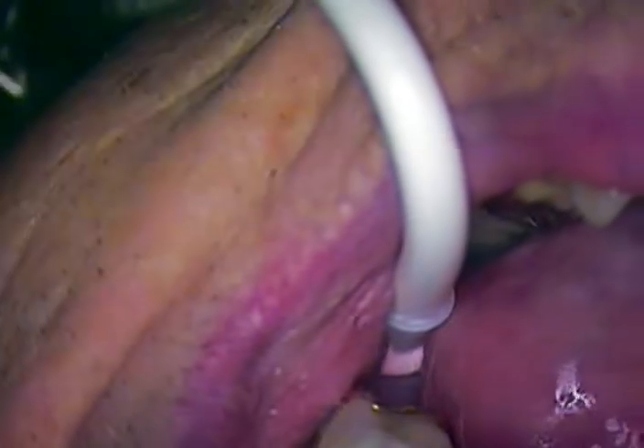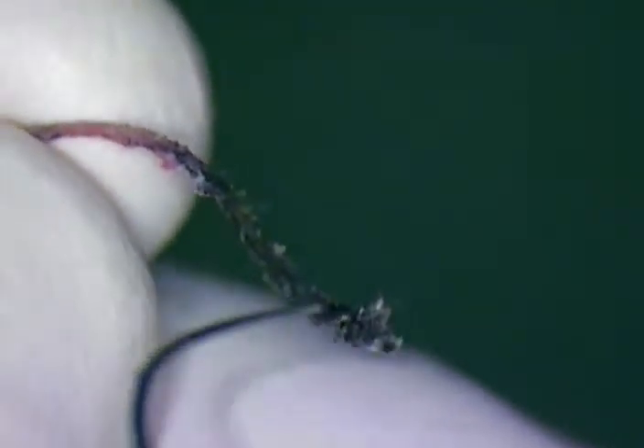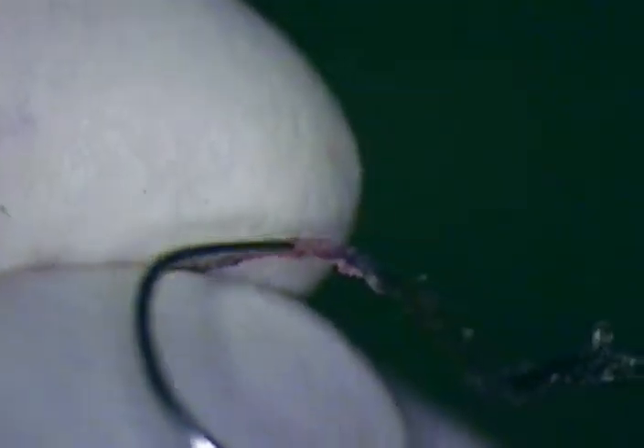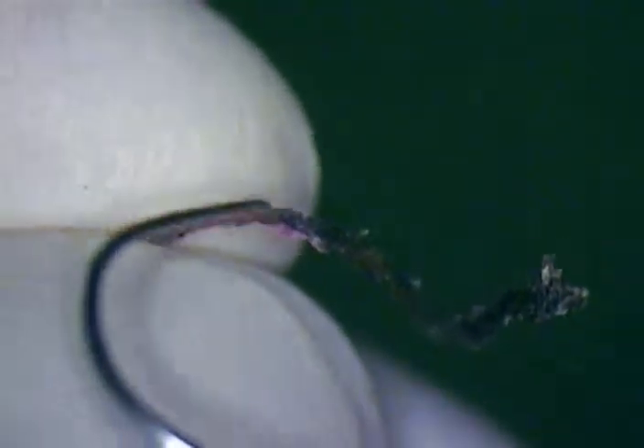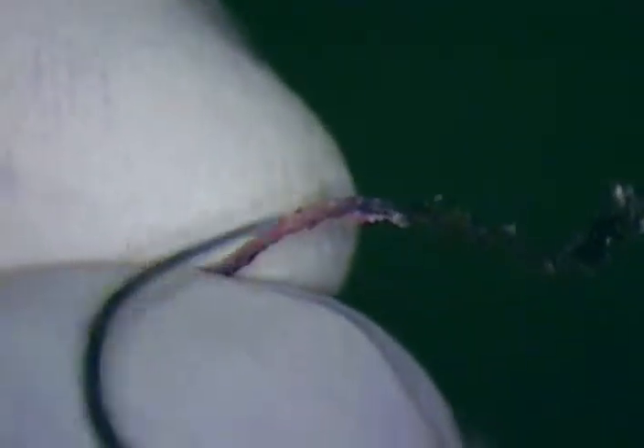I want to take a good look at that cord and see what's on it. Not only do you see cement, you'll see some soft tissue — some of the coagulum from soft tissue that could have gotten up underneath the crown and could have caused the cement not to set properly. So we had a barrier for that. There aren't any little pieces or strings attached to this — no fibers come apart because it's braided. This is siltrax number seven from Pascal and it works absolutely perfect for this type of procedure.